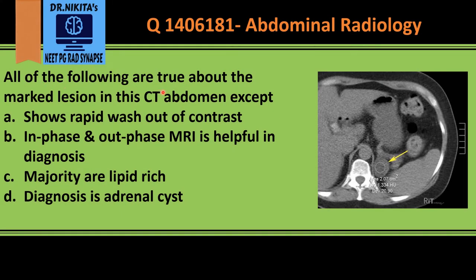All of the following are true about the marked lesion in the CT abdomen except. This is a CT abdomen where the bones are white, so it's a CT scan. It is a non-contrast CT because the aorta is gray — in a contrast CT the aorta would be white. We see this lesion which is medial to the spleen, and lateral to the diaphragmatic crus, which is the location of the adrenal gland.